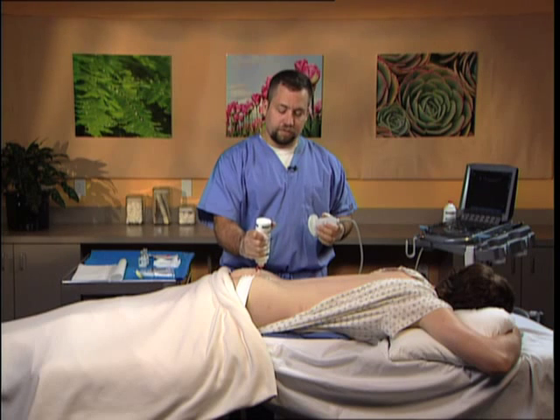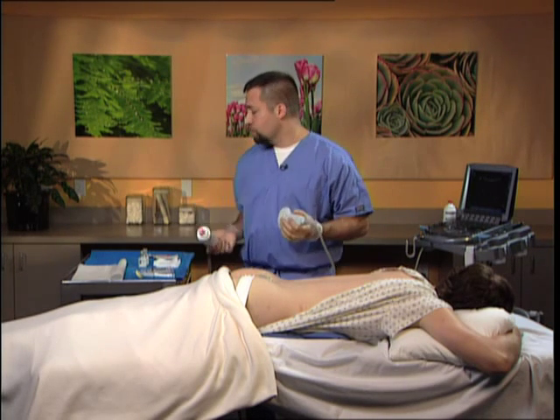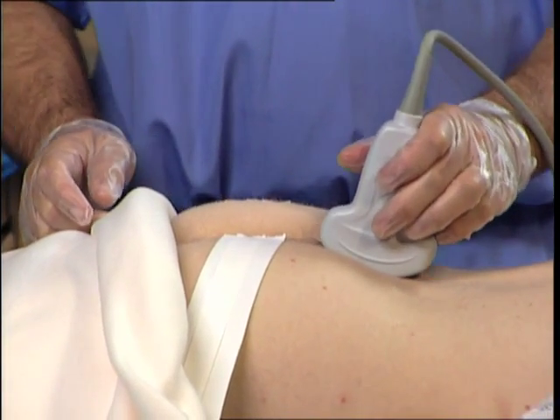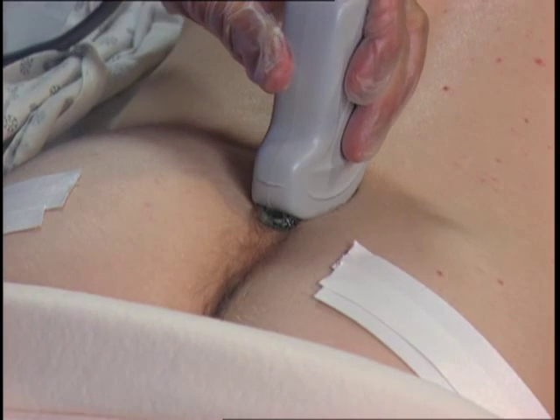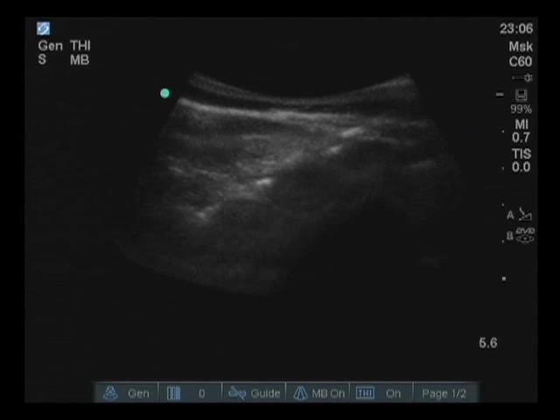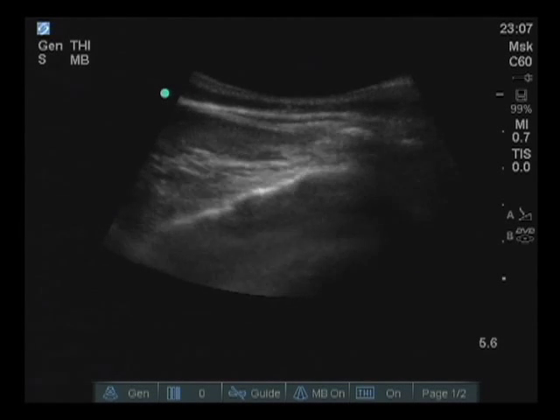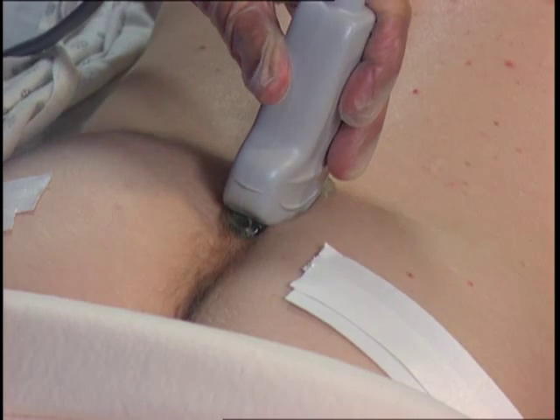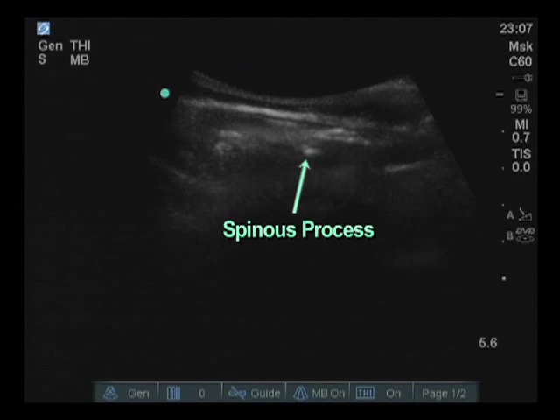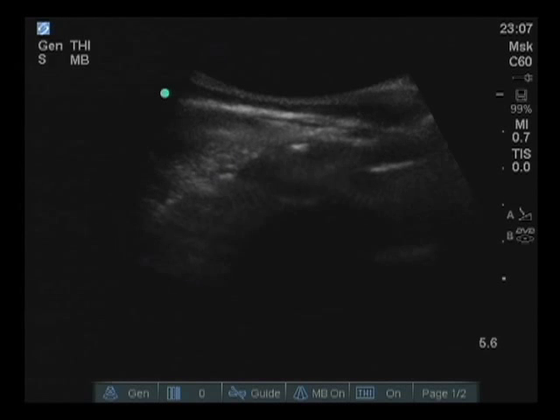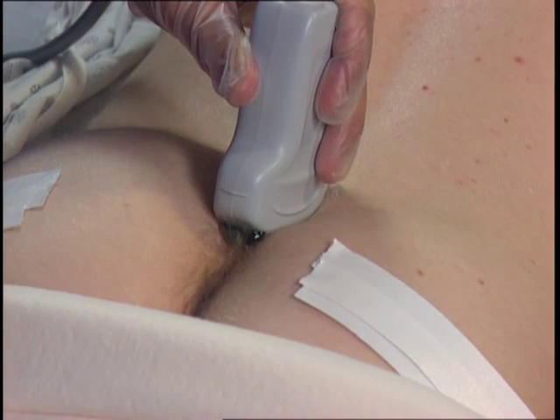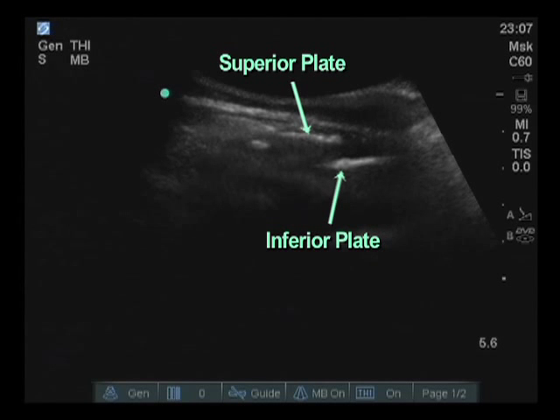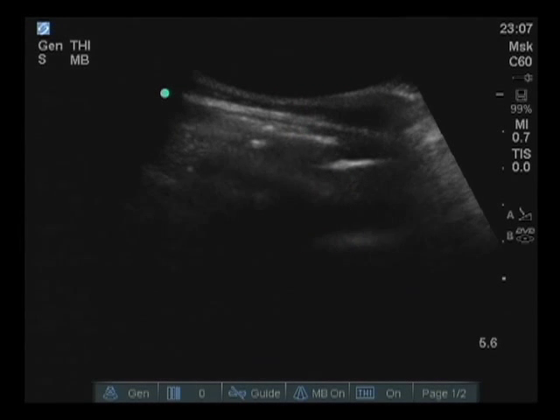Placement of a copious amount of gel for aqueous coupling is important to enhance resolution on the screen. Contact is made in the midline. Because there is anatomic variation in the midline physiologically, a sagittal view and then gently rocking the probe in the oblique direction can help find the spinous processes of the sacral space. The probe is then moved caudally, and very clearly the sacral hiatus comes into view. There is a superior plate and an inferior plate, and in between them is the sacral hiatus.